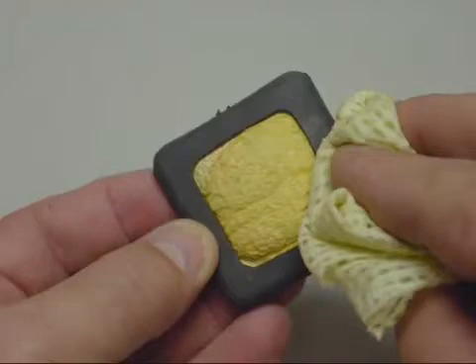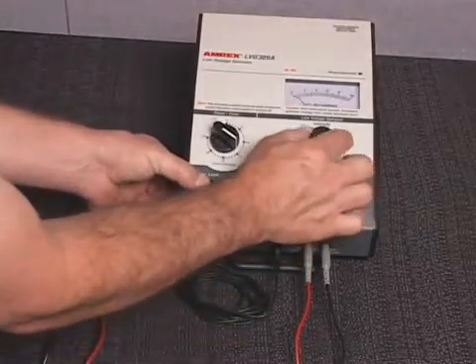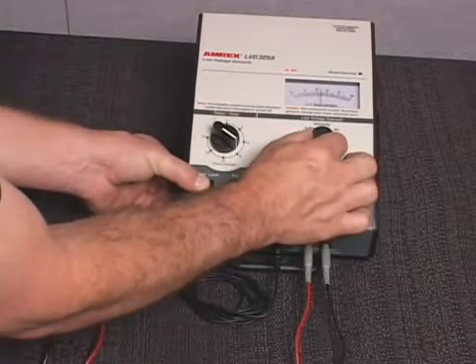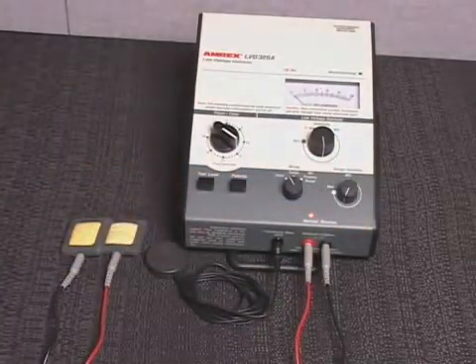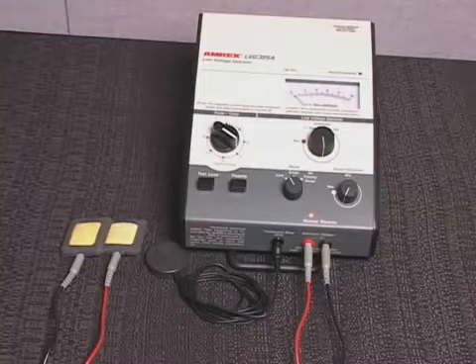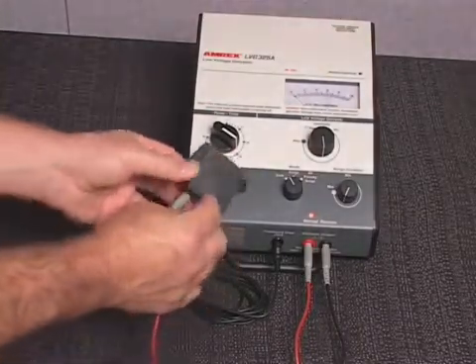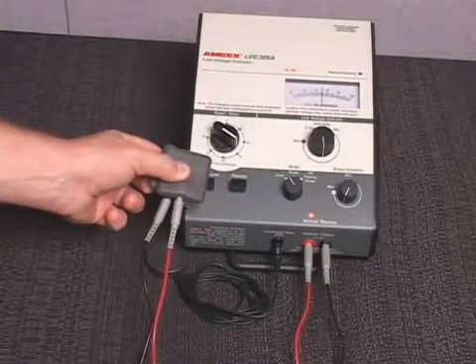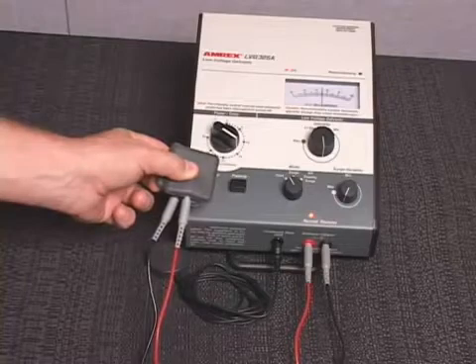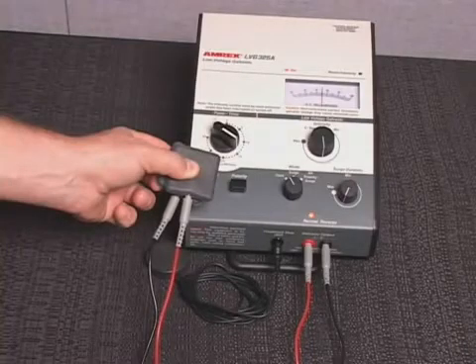Thoroughly clean the sponge pad electrodes with warm water. To verify patient lead and pad electrode conductivity, depress the test load switch and adjust the low voltage galvanic intensity control until DC output indicates 5 mA on the low voltage galvanic meter dial. Release the test load switch and make no further adjustments to the intensity control. Place the patient pad electrodes active faces in full contact with each other and observe the output current displayed on the low voltage galvanic meter dial. If the output current from the patient leads and pad electrodes is less than 5 mA, replacement is indicated.